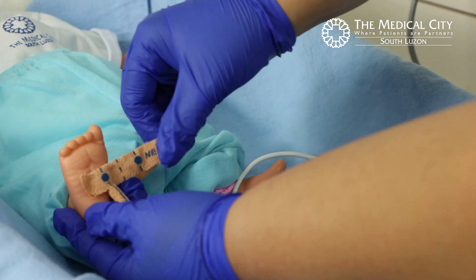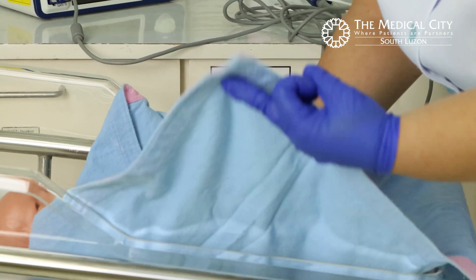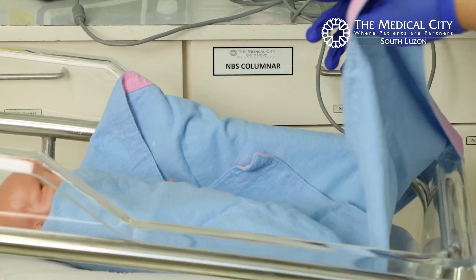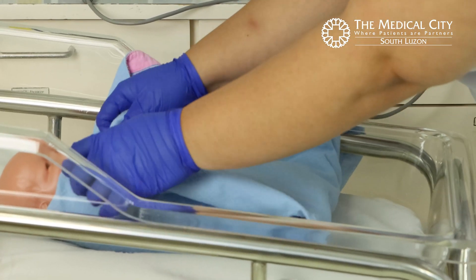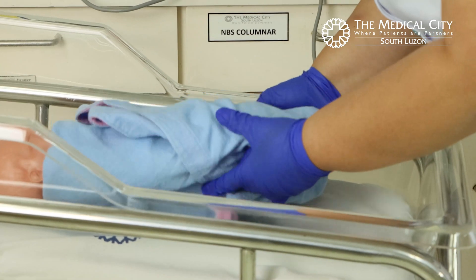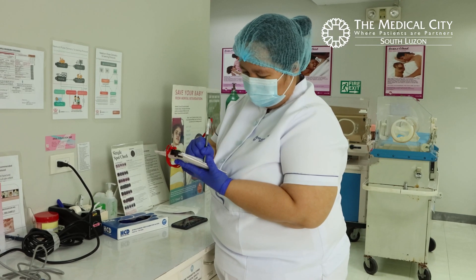Remove the probe and reswaddle the patient. Record both readings.